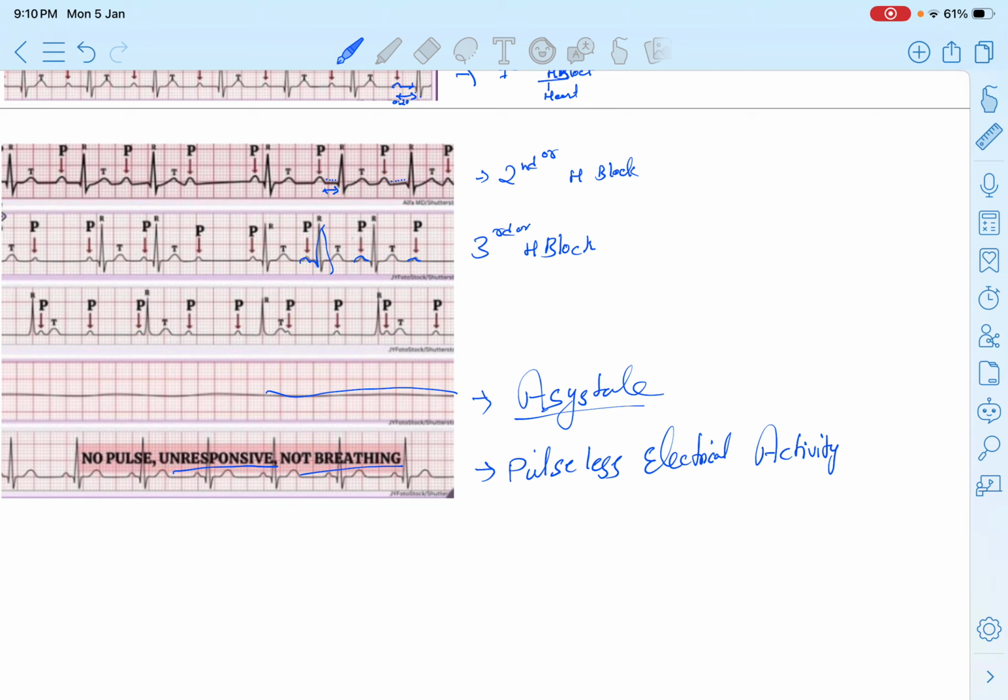I am telling you a huge point. Always check the patient first, not only the ECG. If you think a loose lead caused a false ECG, it may mimic tachycardia, ventricular tachycardia, or fibrillation. Those are the emergency rhythms. Okay.